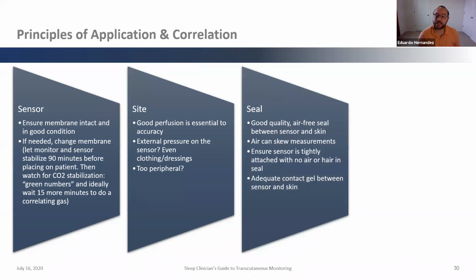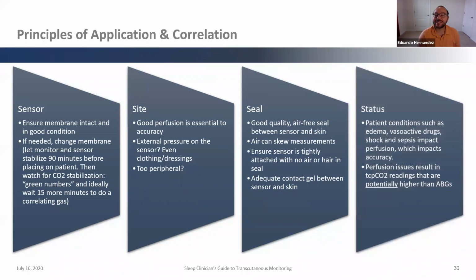So then once you've selected your site, you're going to insert the sensor to that site. You want to make sure there's a good seal. If for some reason it's lifting up, if the cable's too short, if the monitor's too far away and the cable has too much tension on it, if there's not any conductive gel in between the sensor and that site, all these things can definitely contaminate your sensor, your readings.